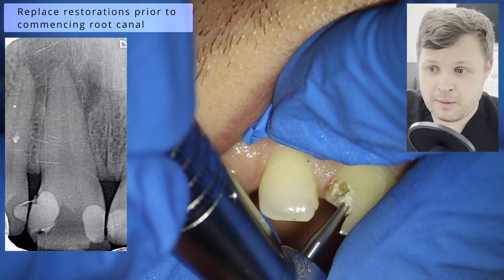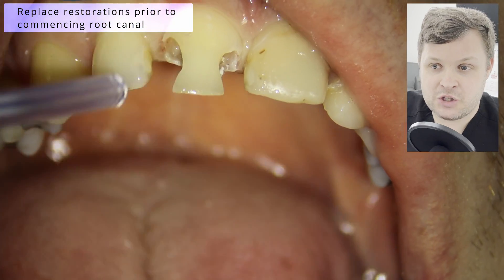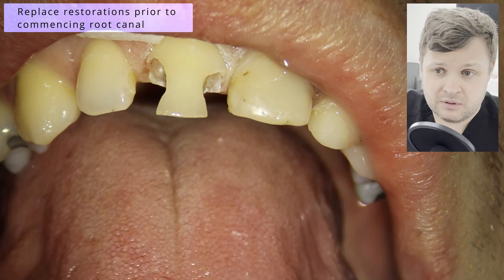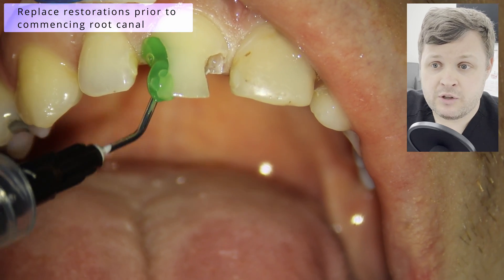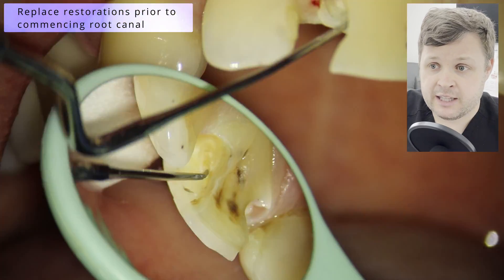I'm probably being a little bit rough here with the rose-head bur, but I know the tooth is completely necrotic so I don't need to worry about that at all. It's just a simple case of removing all of the fillings and also removing all of the undermined enamel.